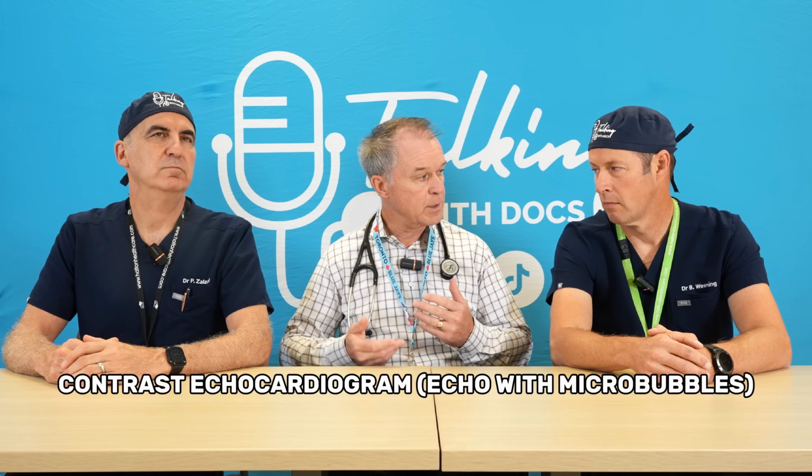There is one thing with echo, and I think more and more people see this now. It's become a standard of care. A lot of times, the echo lab may say, "Hey, we want to inject this thing called contrast, where there are really little microbubbles." And so safe. We inject these microbubbles when we do the echo. It goes into the chamber of the heart. It improves the imaging quality significantly.